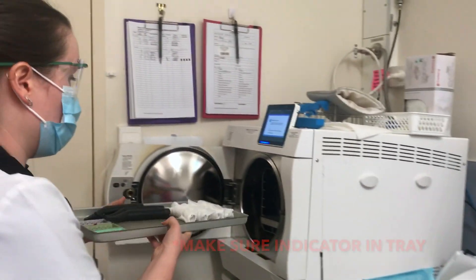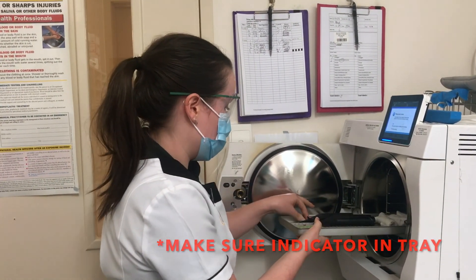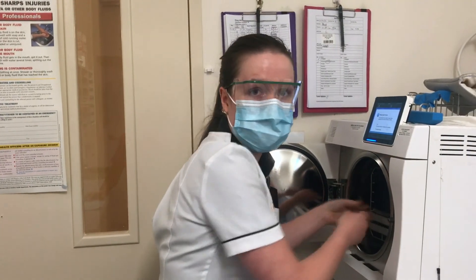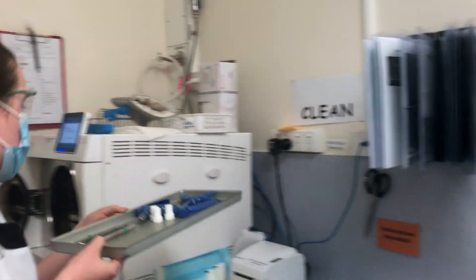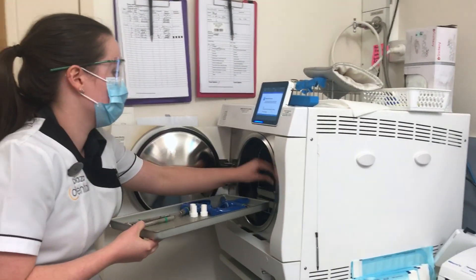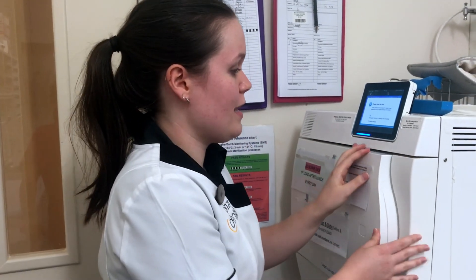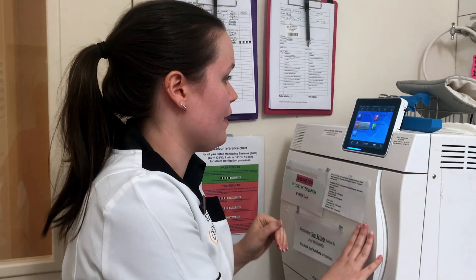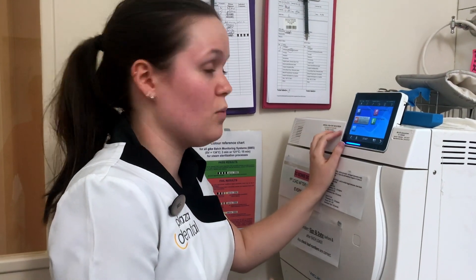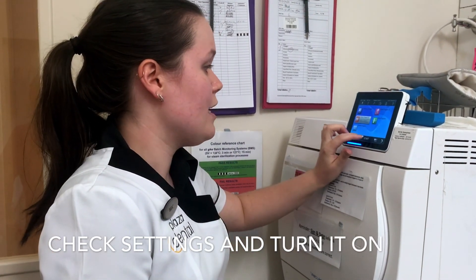When we're doing our autoclaving, we always make sure we have an indicator in there as well, just to make sure that the sterilization cycle has gone through. It's just another check we do to ensure everything is running as it's supposed to. We always make sure the autoclave is empty when we start, so that way we're not confusing dirty with clean. Once we've decided which instruments we're doing and what loads they're putting through, we just press start.